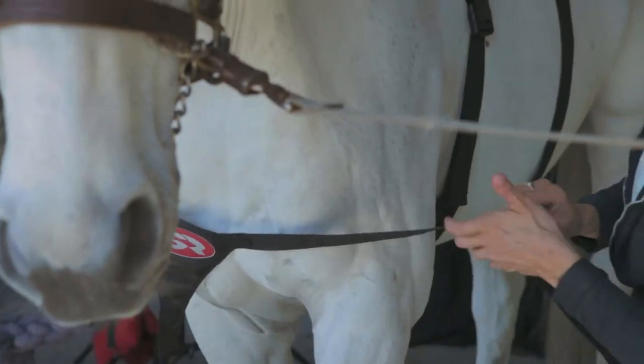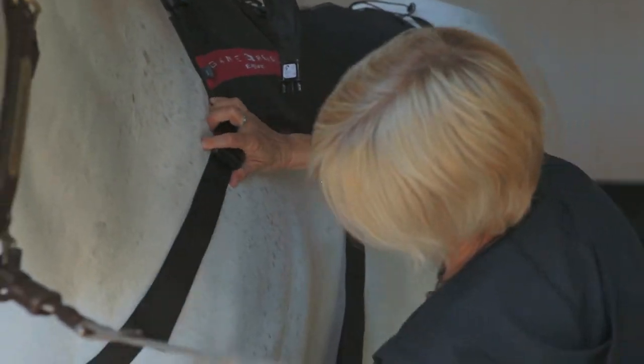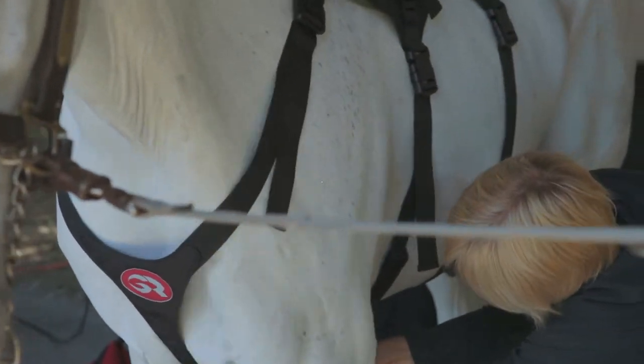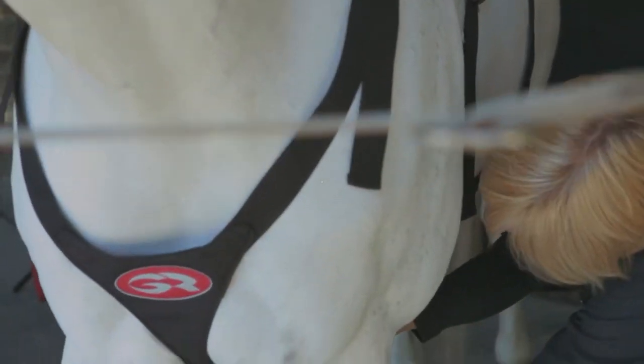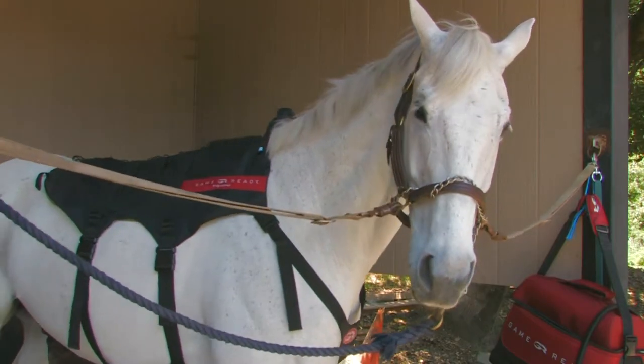Step 3. Clip the upper breastplate straps into either side of the backwrap at the horse's shoulders. Pass the bottom breastplate strap through the horse's front legs and clip to the front surcingle strap. Adjust the tautness by shortening the nylon straps at all points.